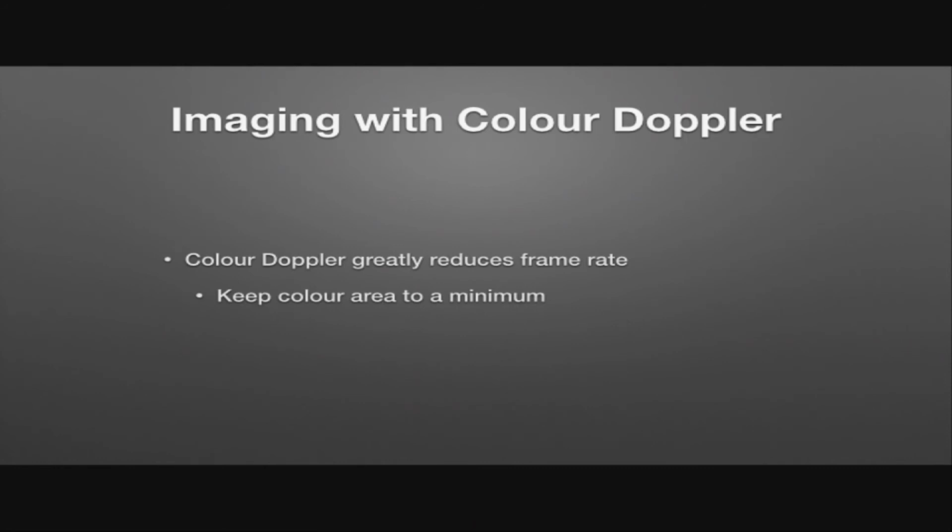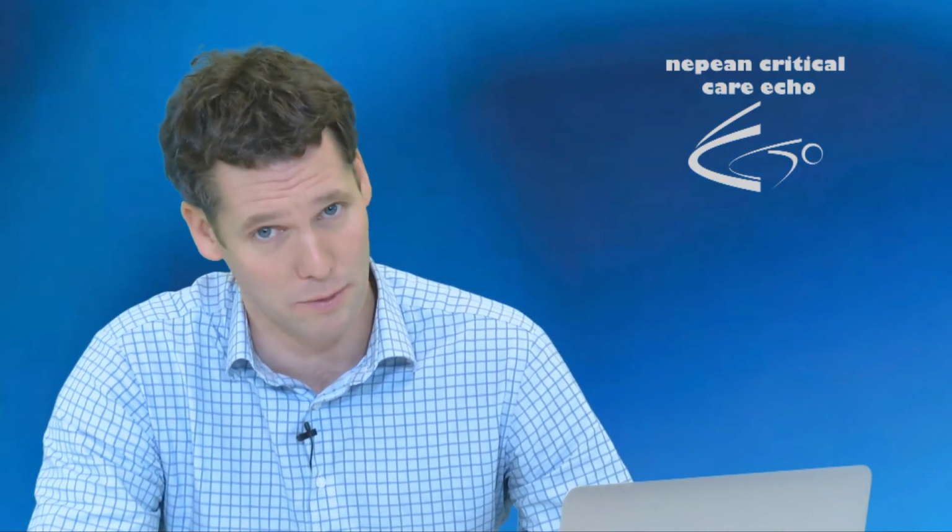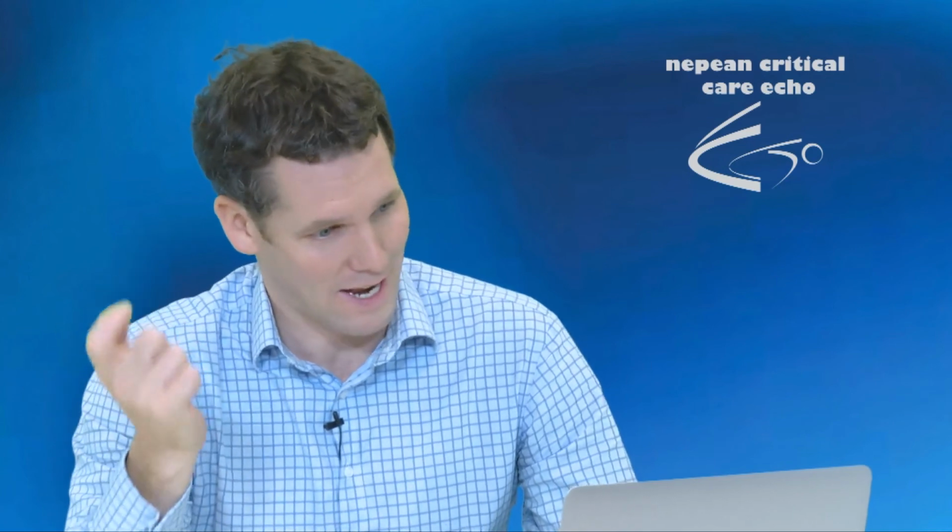So I'll just mention a little bit about imaging with color Doppler, and as we said, we know that color Doppler greatly reduces your frame rate because you're showing both the B mode, or the brightness mode, the 2D picture, as well as the color Doppler. So you're going to want to keep your color area to a minimum, I think is the first one, about trying to optimize your color Doppler imaging. And then the other things that are important are to look at both gain and your scale.